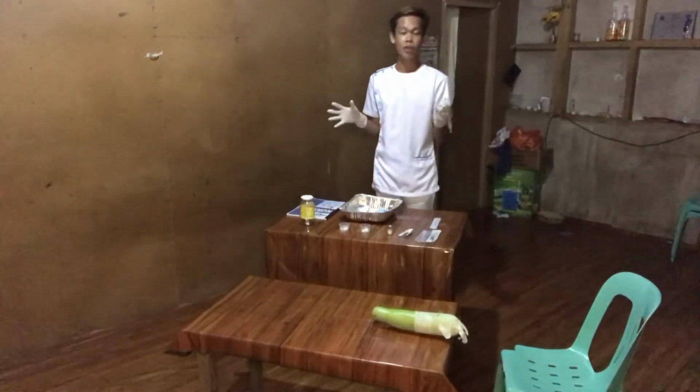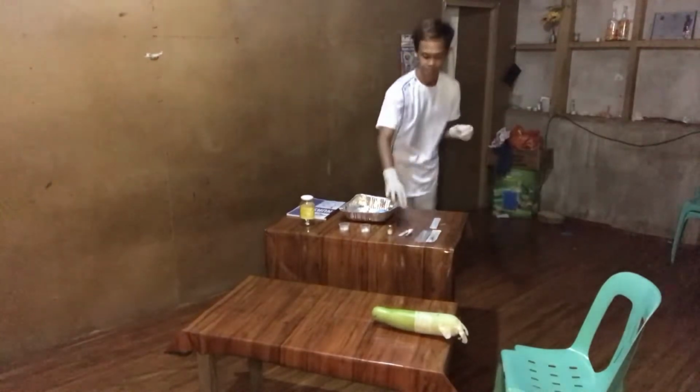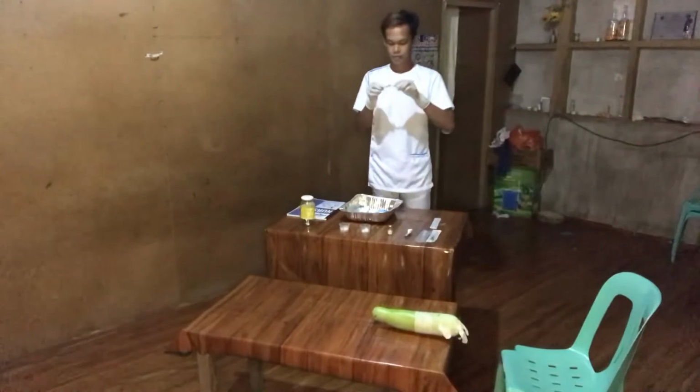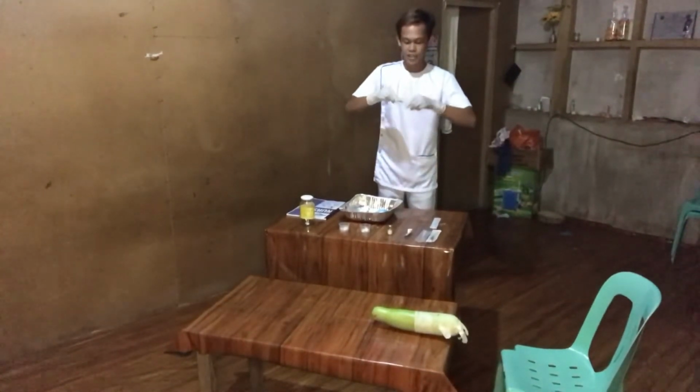Then we're going to connect the tuberculin syringe to the aspirating needle. Secure that the connection isn't loose.